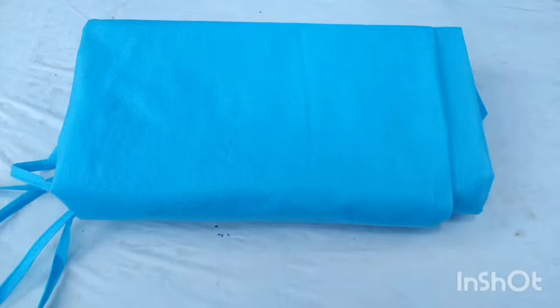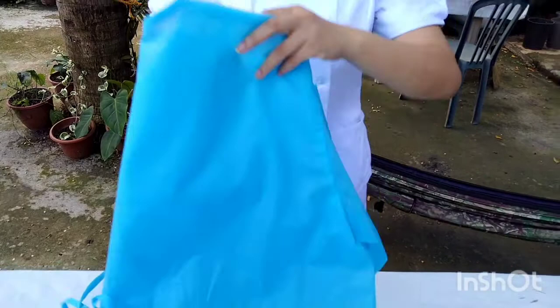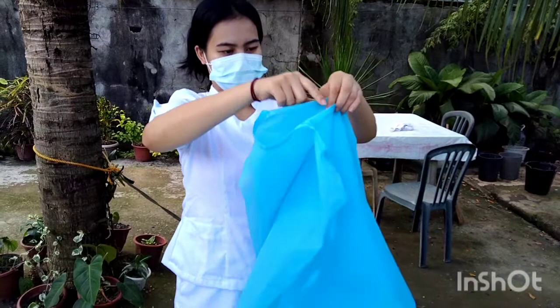After that, ask the circulating nurse to assist by opening the sterile pack containing the sterile gown. The gown's outer surface remains sterile. Assume that the nurse has a glove and pick up the sterile gown below the neck edge, lift it directly upward, and step away from the table. This provides a wide margin of safety, avoiding contamination of the gown or sterile field or table.